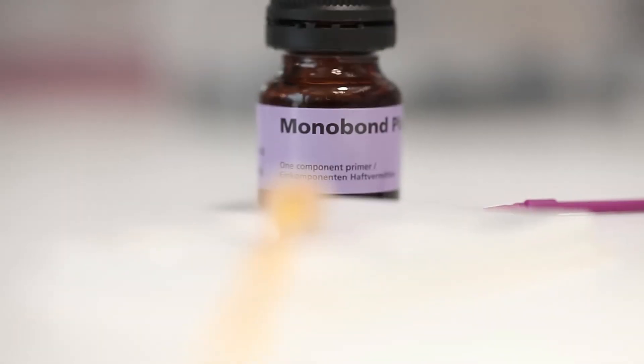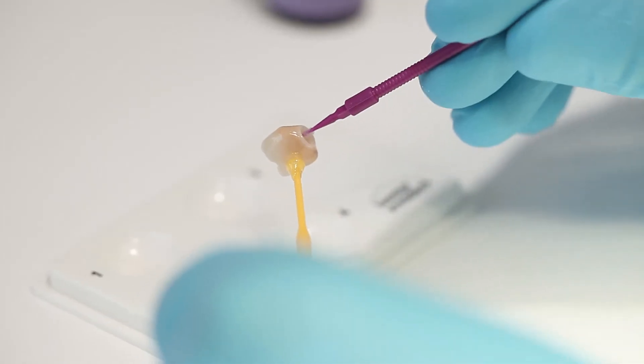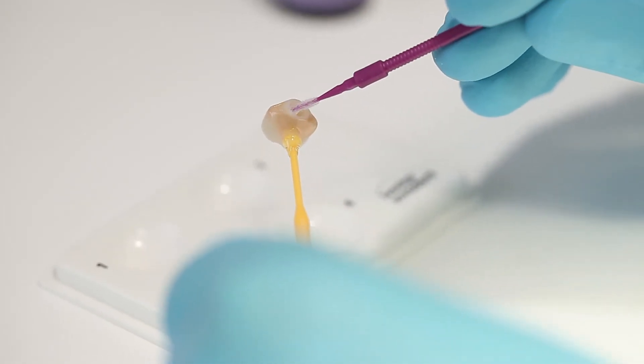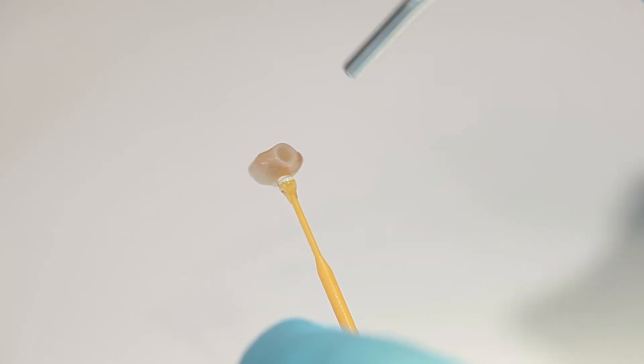Apply monobond plus to the dried bonding surface and allow to react for 60 seconds. Then evaporate any remaining excess with air that is free of water and oil.